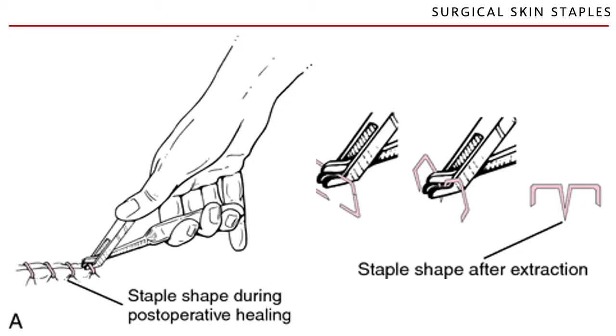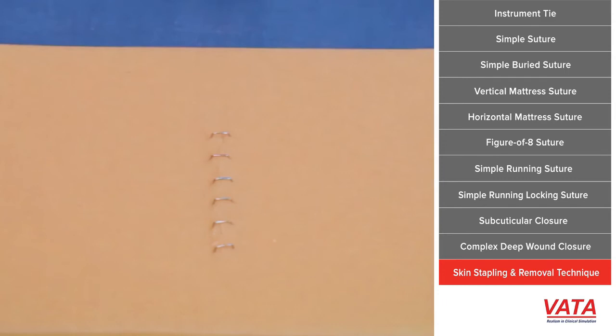All right. So the way that we remove them is also important. We don't want the tissue that it has been opposing to be damaged by the removal of the staple, because it has already adhered. Why would we damage the tissue just to remove the staple wire? So there's also a staple remover for that. Okay? So this is how it's done.